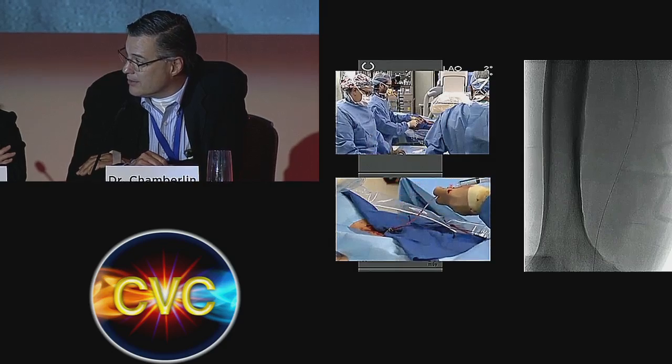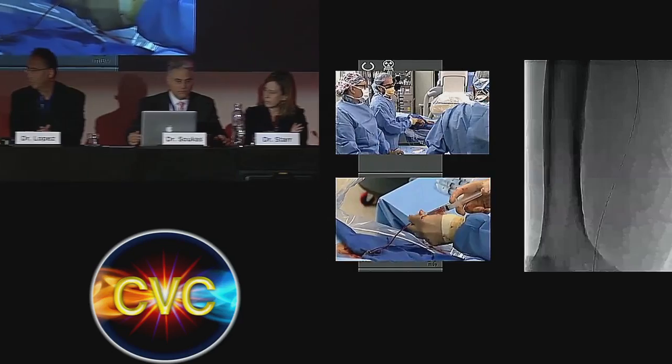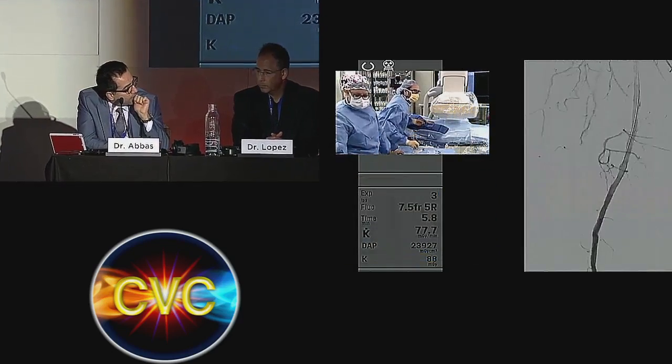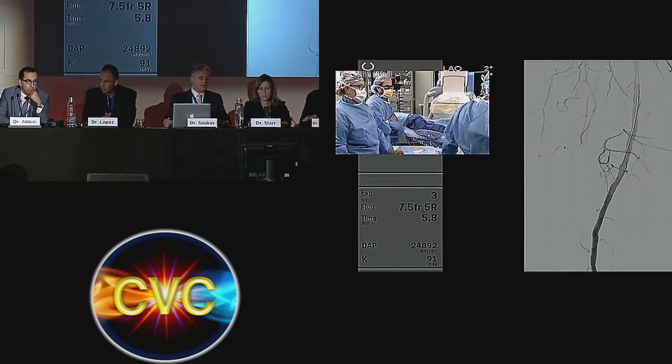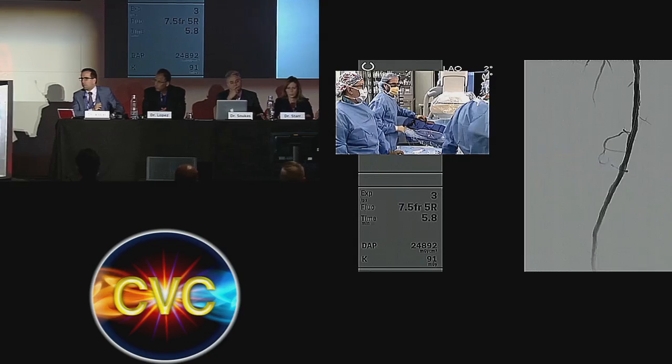And I agree it needs to be treated. Although this area is very risky with atherectomy, sometimes that bend is kind of risky. You create some fistula or major dissection. That's the only thing. Are you around the bend enough to be safe? You'd be a little more cautious. Maybe you wouldn't cut very much on the bend. Miguel, does this patient have any foot symptoms?